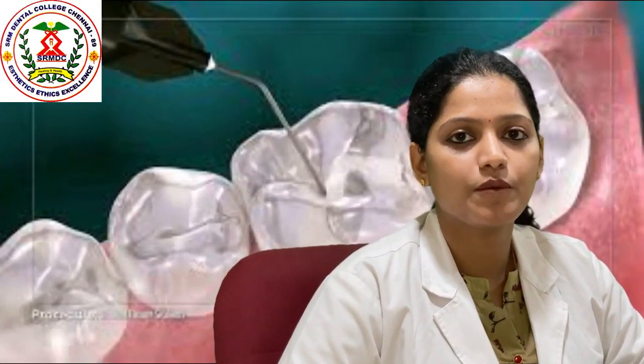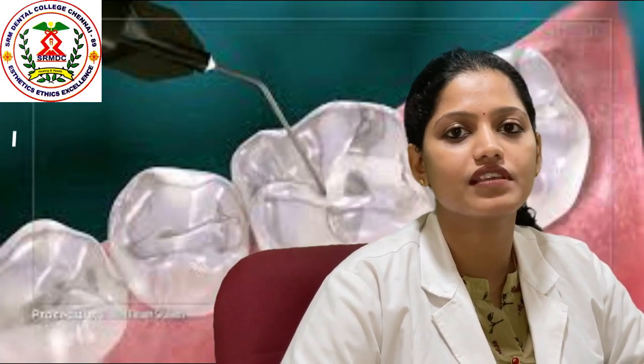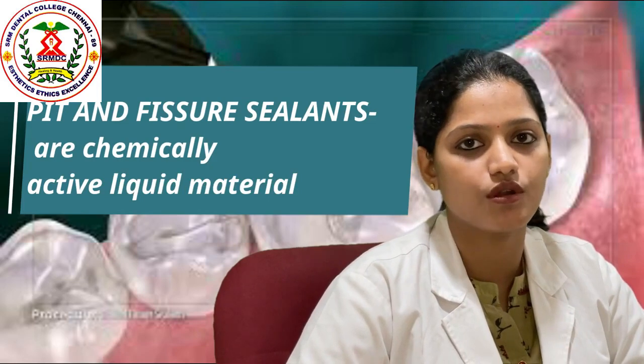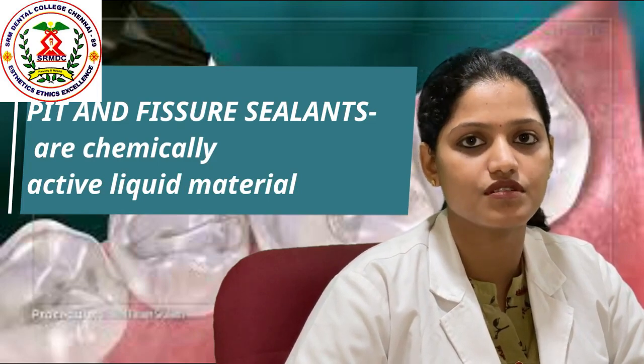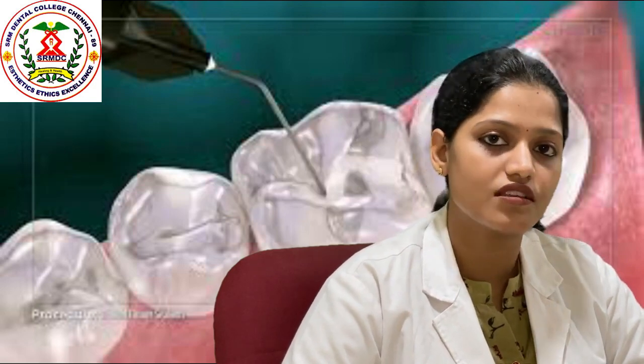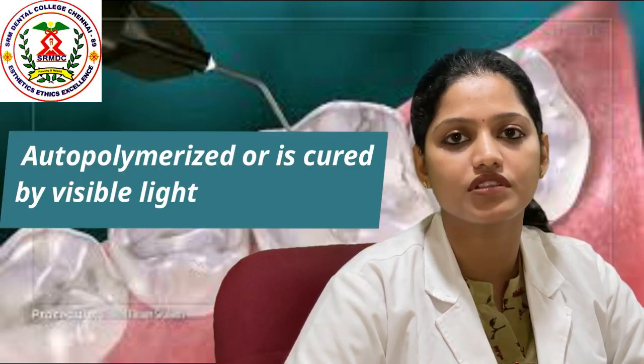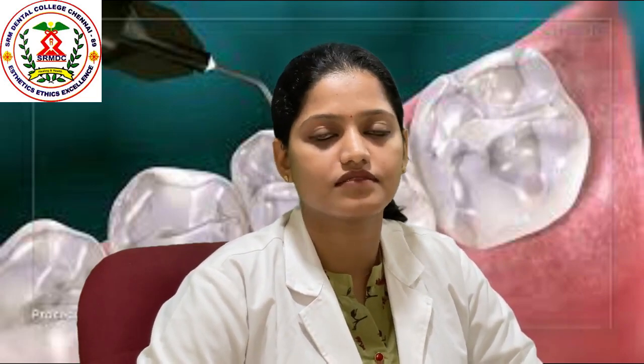Now let us see about pit and fissure sealant. Pit and fissure sealant is a chemically active liquid material which is introduced onto the occlusal pits and fissures of a caries susceptible tooth. After application, it either cures chemically, in other words, it is autopolymerized, or is cured with a visible light, that is light cure, which forms a micromechanically bonded protective layer that prevents the invasion of caries producing bacteria.